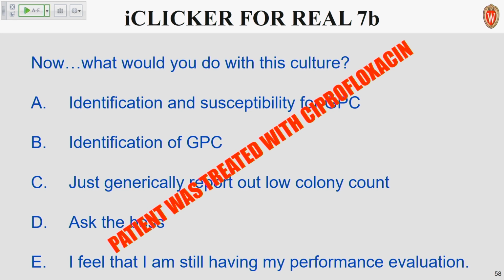If it's a woman of childbearing age, we would do a MALDI to rule out saprophyticus. We would identify that, and then we've got a canned comment that we put in about susceptibility. But even if it's a patient with over 100,000 coag negative staph, we're not supposed to do susceptibility, even on a cath urine. So I'm just wondering about other people.